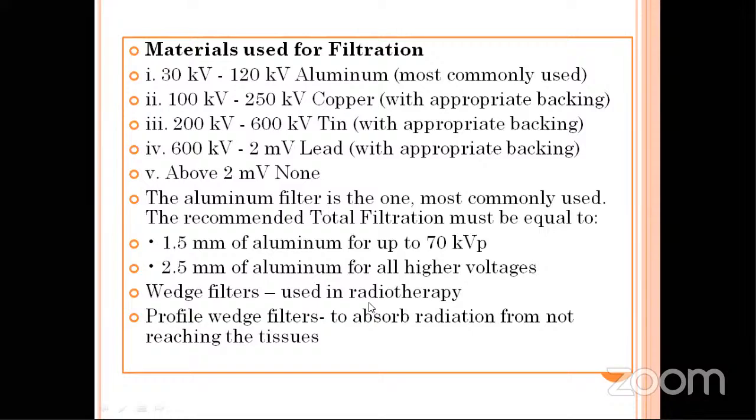And profile wedge filters are used to absorb radiation from not reaching the tissues. Earlier days, while taking Ceph, they wanted a soft tissue profile also. So in order to get that, profile wedge filters were used. But now we don't do that. Just know it for your MCQ purpose. Profile wedge filters are used to absorb radiation from not reaching the tissues.